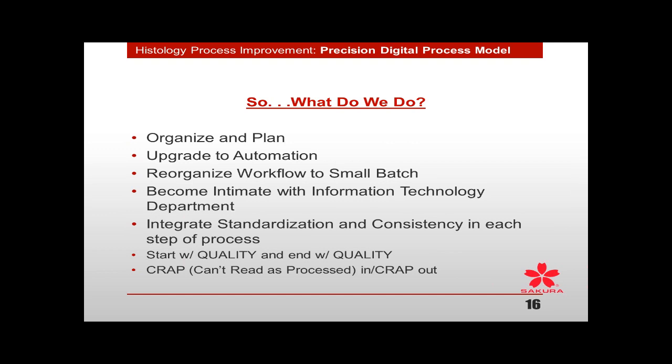Putting slides into a scanner and creating a digital image, pretty much you can own. Now, if you want to use that digital image and actually get it to somebody like the pathologist, if you're not fully engaged with your information technology department, it's not going to happen. So then you're not going to be successful. You have to integrate standardization and consistency in each step of your process.